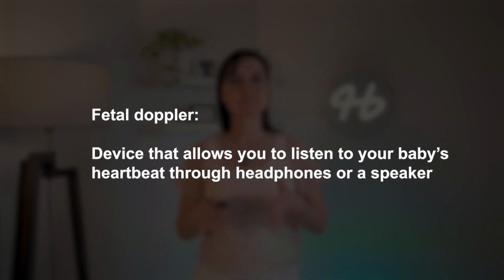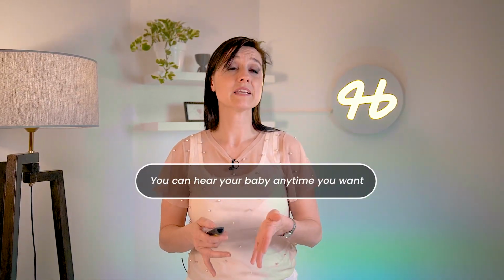Have you used a fetal Doppler yet? If you're new to the idea, or are about to get one, or are thinking of getting one, I think this is the video for you. A fetal Doppler is a device that allows you to listen to your baby's heartbeat through headphones or a speaker. Usually this special activity only happens during ultrasounds, but now you can hear your baby's rhythm anytime you want.